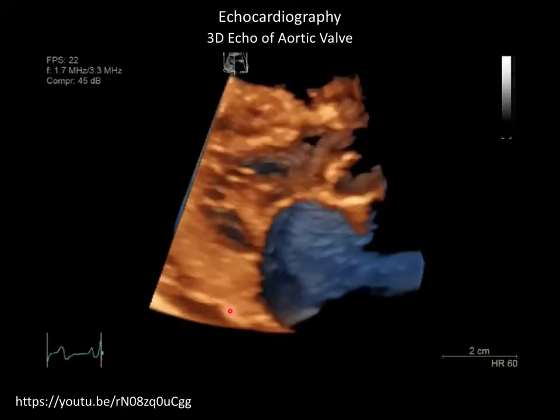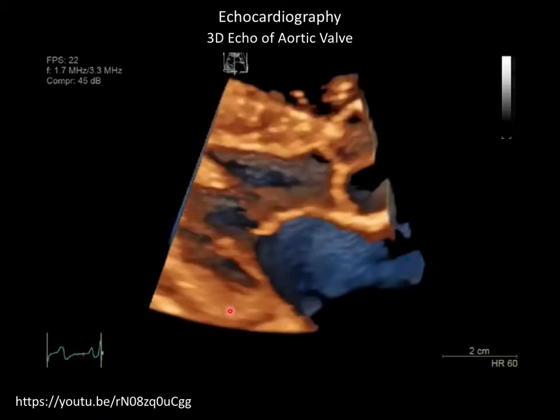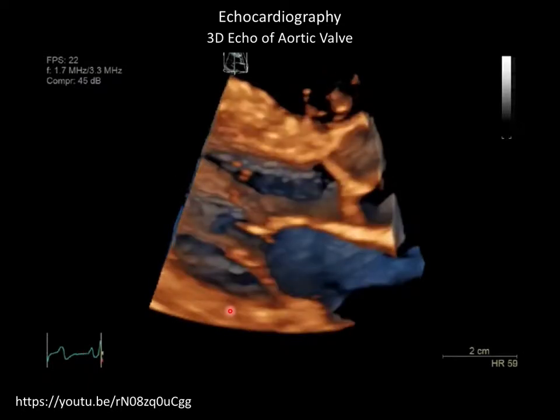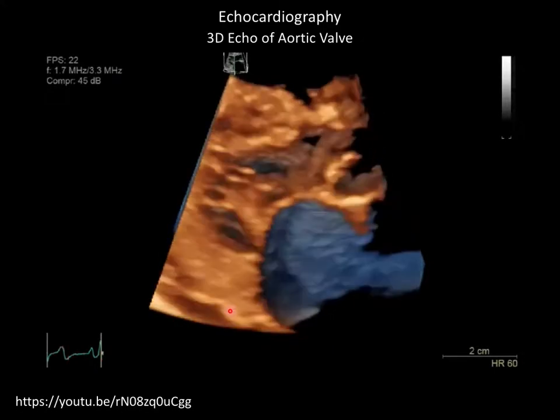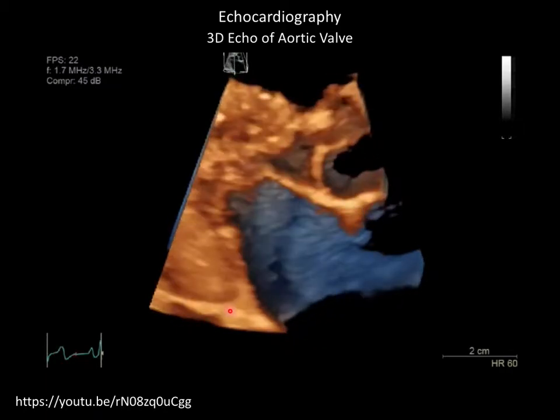And you put all the data together from 8 heartbeats or 16. CT, it used to be that you would require about 3 heartbeats. Now that these CT scanners have very large detectors, if you have a large detector, you can get it all on 1 beat. So it simplifies your life, right? And it also makes the data much more stable and robust. So any questions about that?